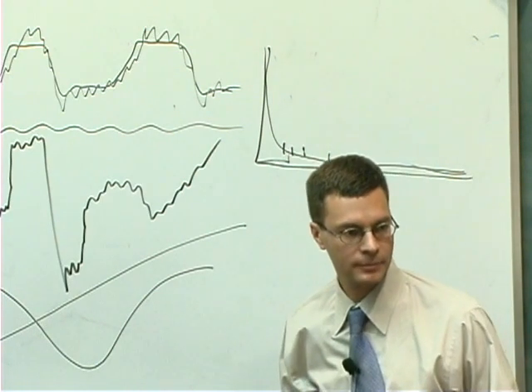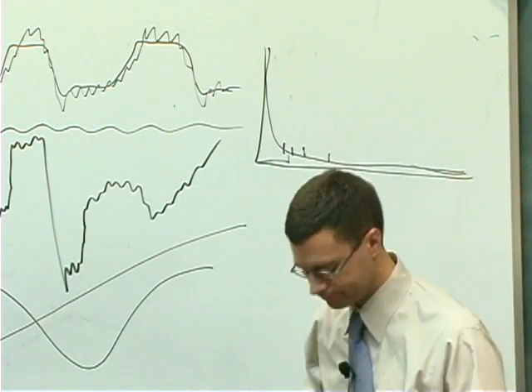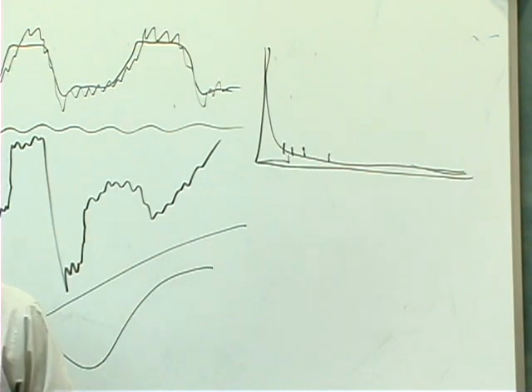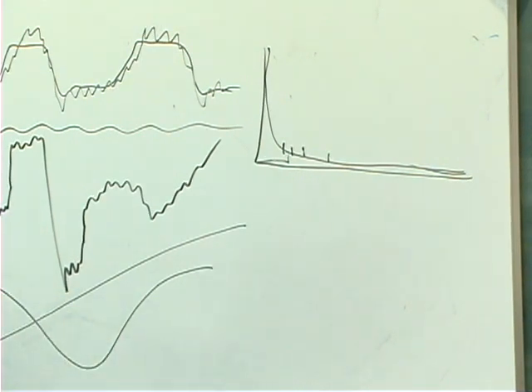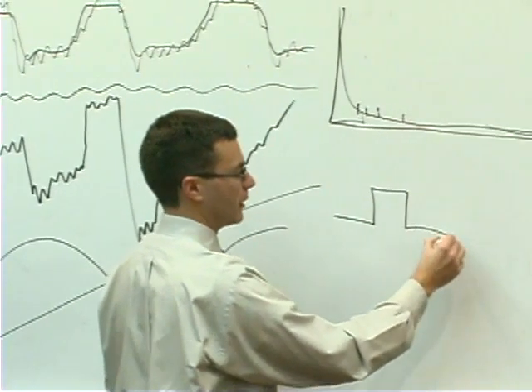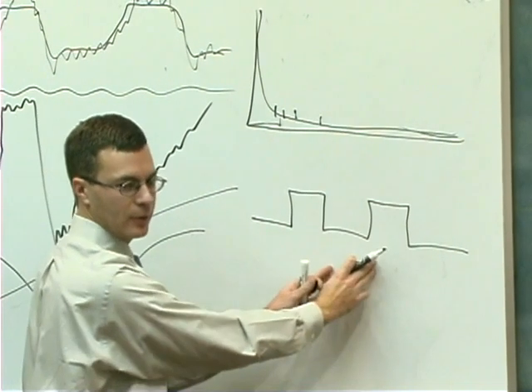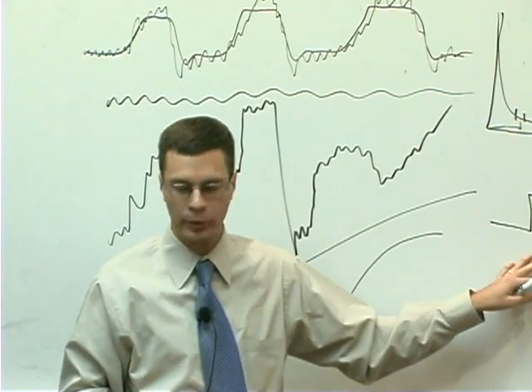Do you have any rules of thumb for when filtering, what sort of tasks? Yeah. So this is an area in desperate need of some rigorous guidelines, and unfortunately there aren't any right now. So here are at least a couple of rules of thumb. If you have a blocked fMRI experimental design, and we haven't even talked too much about different types of experimental designs, which we're going to do right after the break, but if you have a blocked design, one in which you have 30 seconds of this, 30 seconds of that, 30 seconds of this, 30 seconds of that, that's a case in which your experimental variance is at a pretty low frequency, right?